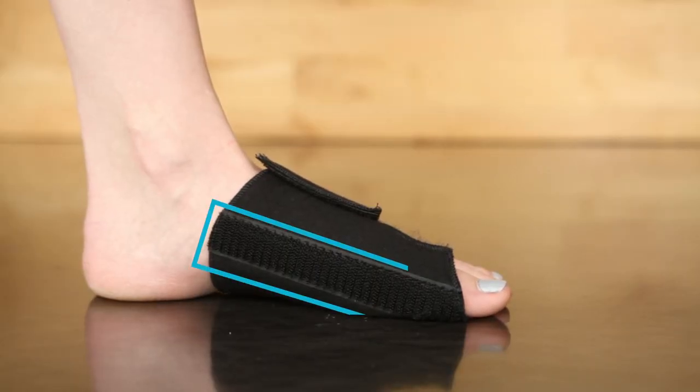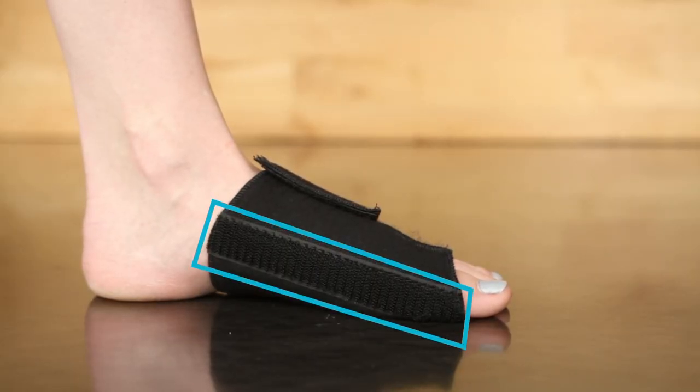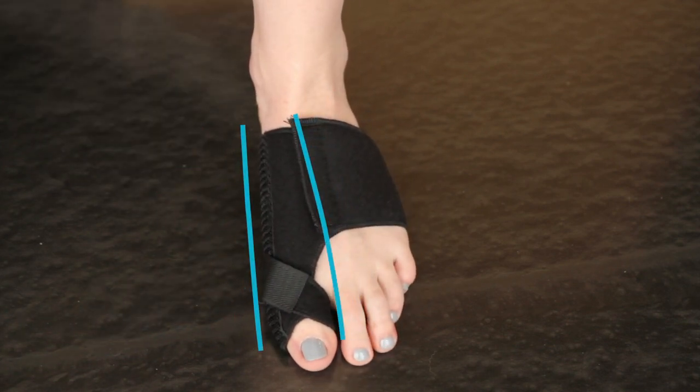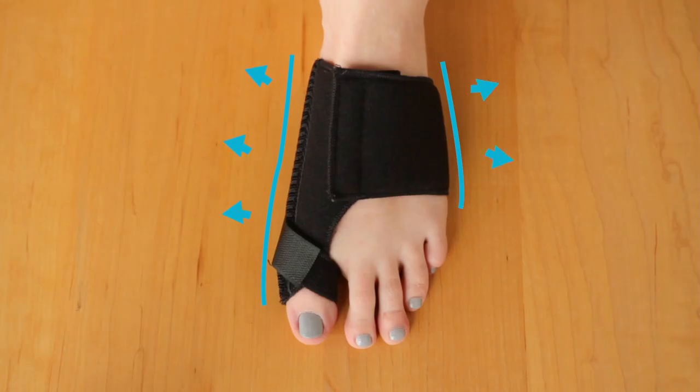This brace features a built-in aluminum splint which applies gentle pressure to your big toe to realign and slow the formation or progression of bunions. Made of ultra soft, lightweight, open cell foam for increased comfort and breathability.